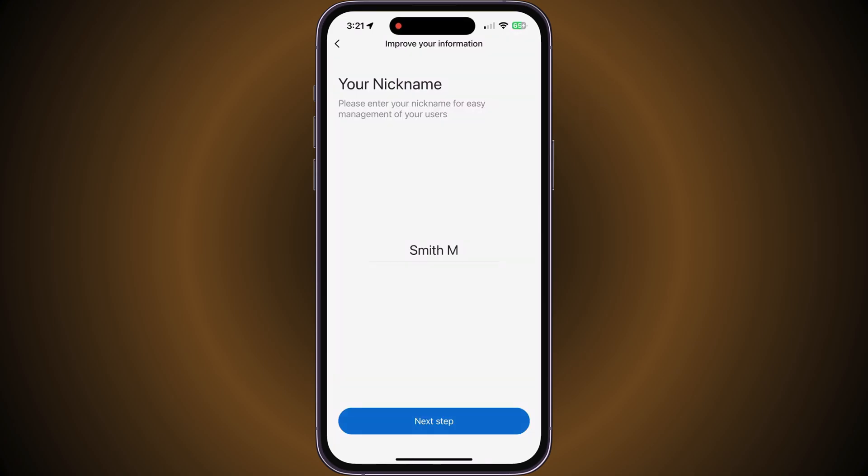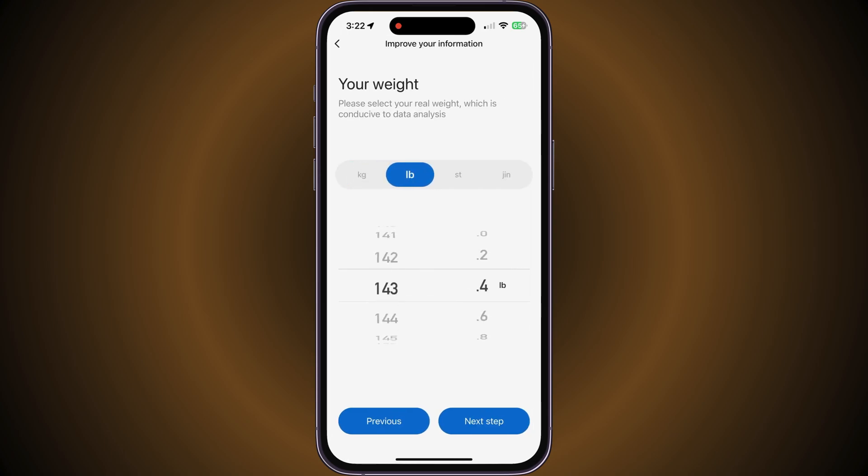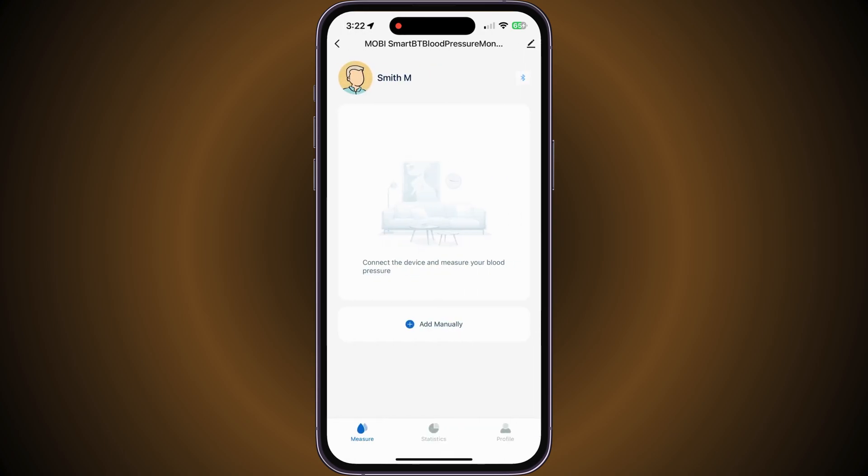Setting up your profile is important. Be sure to include a nickname, select your gender, add your birthday, add your height, and lastly, add your weight. These factors are essential for the blood pressure machine to provide results based on your biometrics.